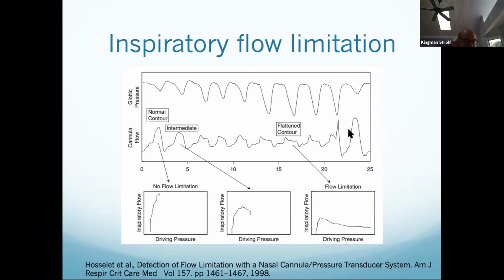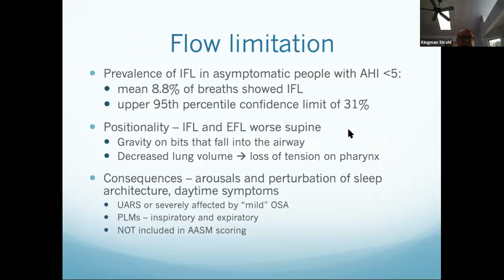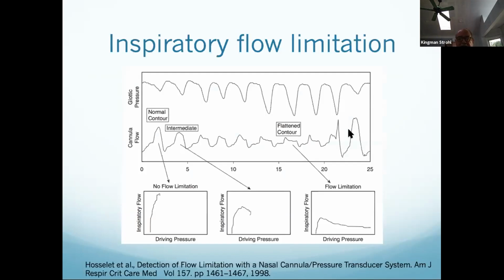I'm sorry to interrupt, but I mean, this is really key. This is really basic stuff. And I'm realizing that this is a lot for people to unpack that's never thought of mechanics before. Because if anyone has ever done cardiac circulation or blood flow through tubes in your vessels or your coronary arteries, they go, oh yeah, I know what you're talking about.